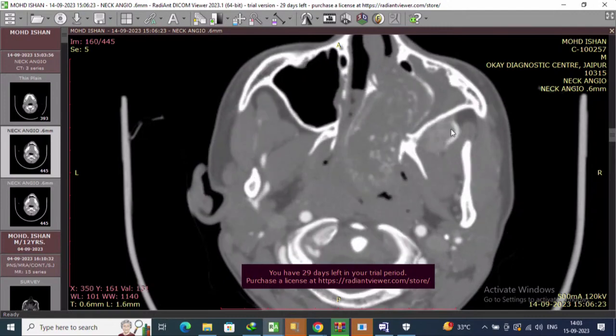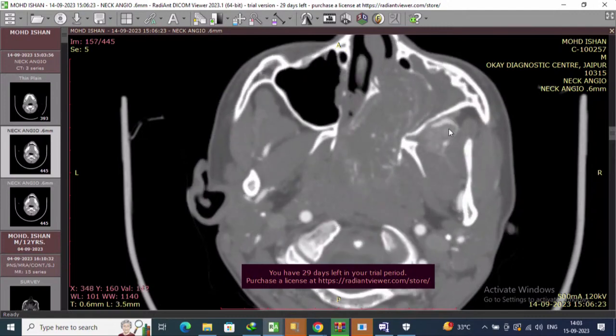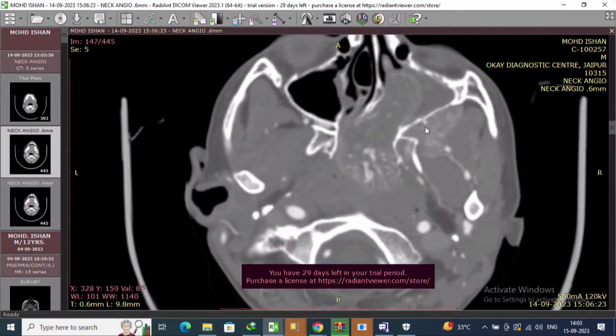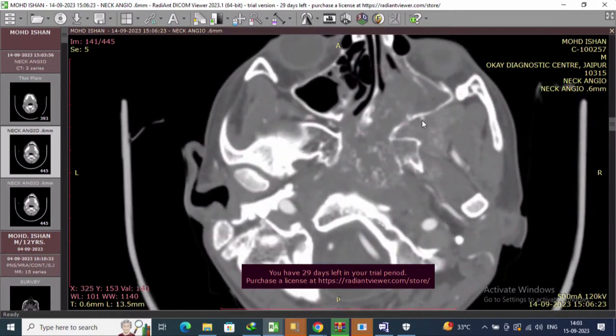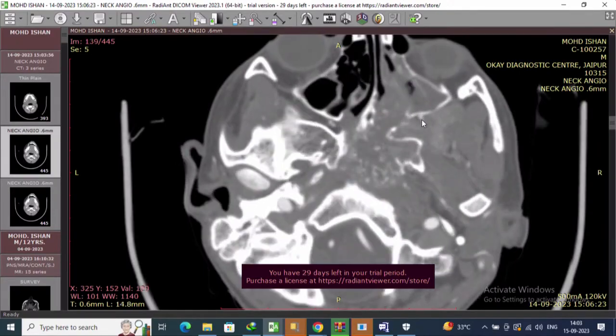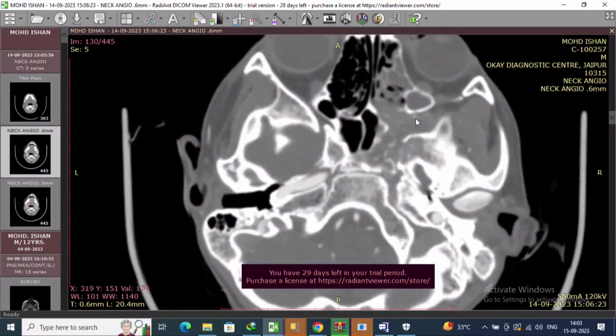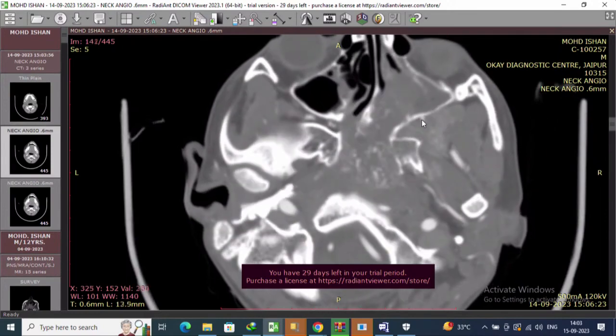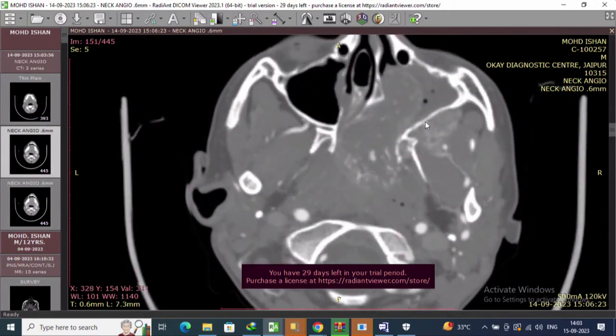So now this is the internal maxillary. Can you see very clear, Dr. Felix? Yes, sir. And see how it is entering into the tumor, just hugging the posterior wall. Can you see? Yes, sir. The moment you remove the posterior wall, just behind the periosteum is going to be this vessel, entering into the tumor here. That's how this vessel is the principal vessel supplying this.